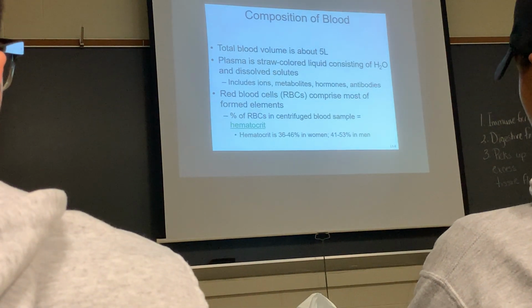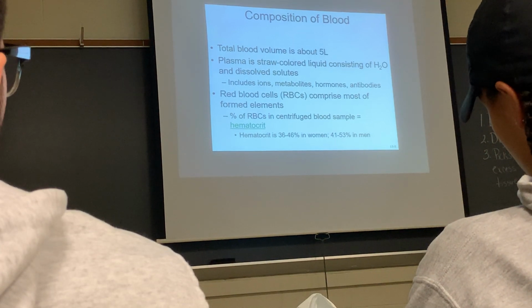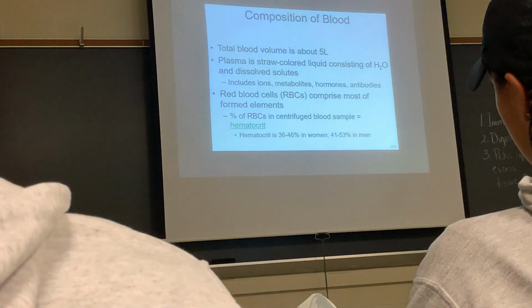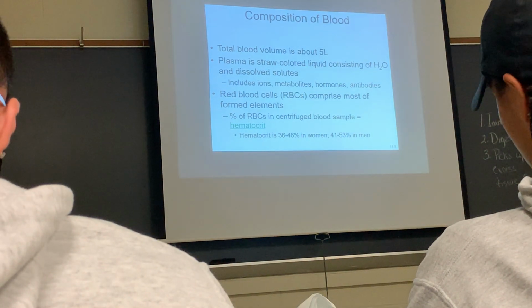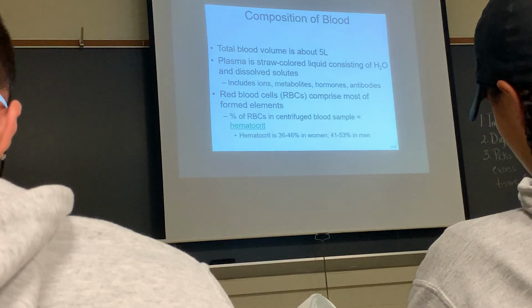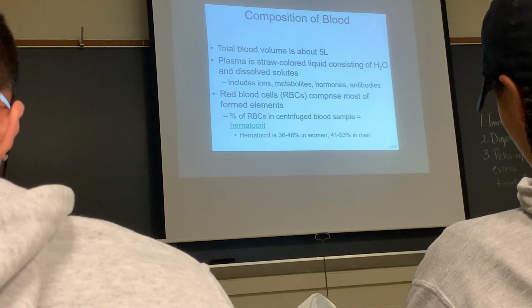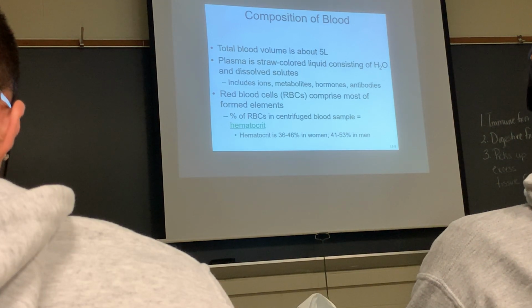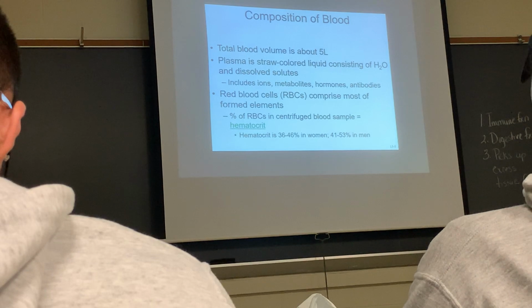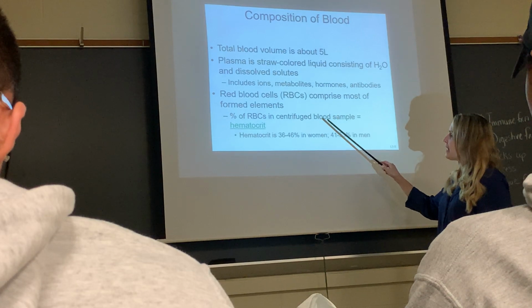So on the handout that you have, if you took a look at the first page, under activity 1, it says hematocrit. It says normal hematocrit for females is 36 to 46%. Normal hematocrit for males is between about 41 to 53%. So that's what I said. It's an average. 45% is about average for people. But that's what we're looking for.